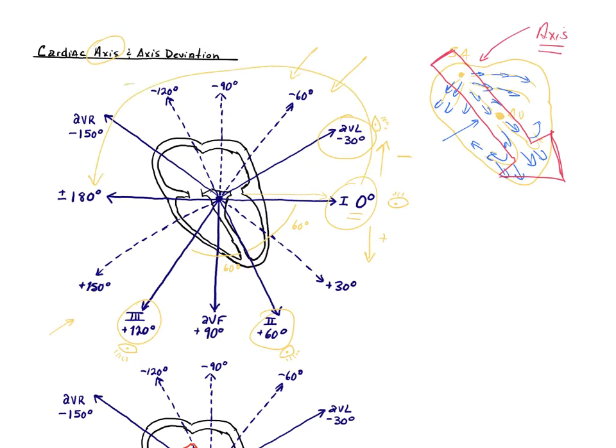These are all negatives. And then the bottom part starts at 0 and goes all the way to 180 degrees, and it includes all the positives. So instead of 360, it's 180 and 180. You guys okay with that? Does that kind of make sense?